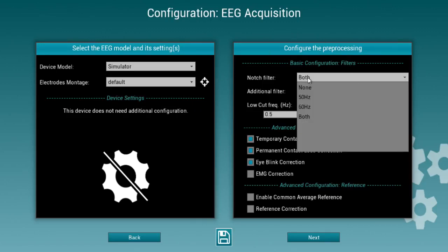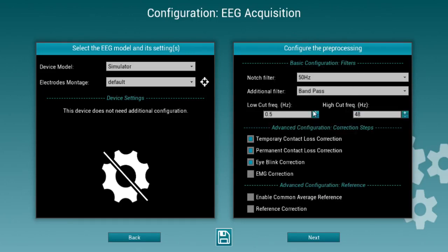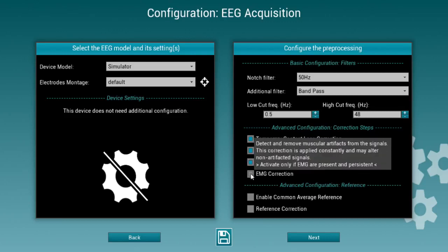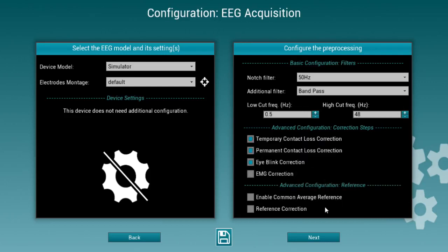Then you have to configure pre-processing: notch filters, bandpass filters and cutoff frequencies, and some advanced signal processing such as temporary contact loss corrections, eye movement corrections, and even EMG corrections. If you're willing to adjust referencing in your EEG montage, this is also possible.